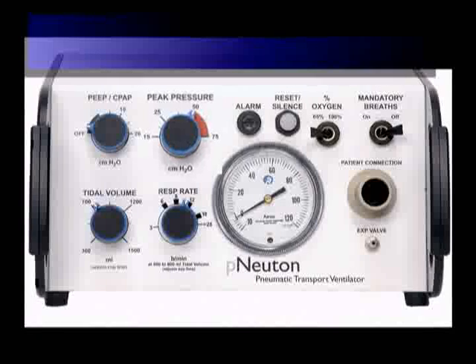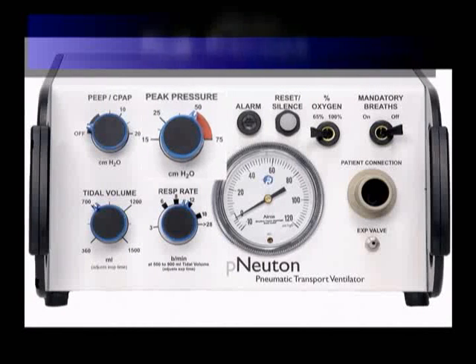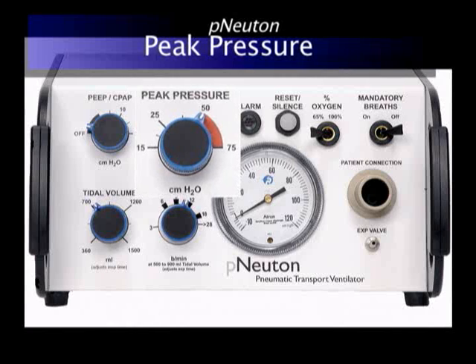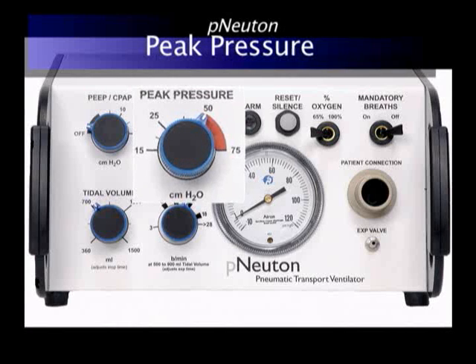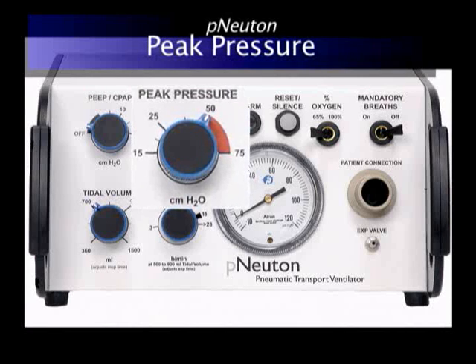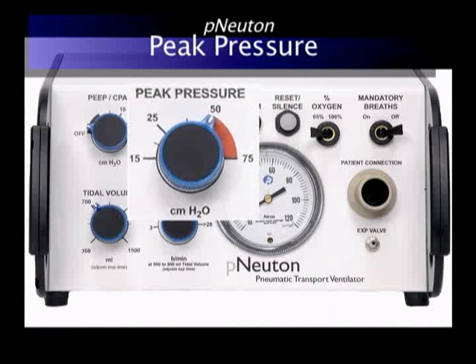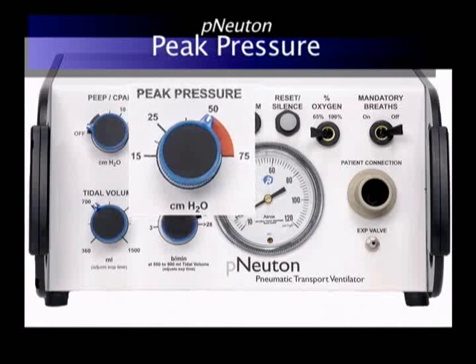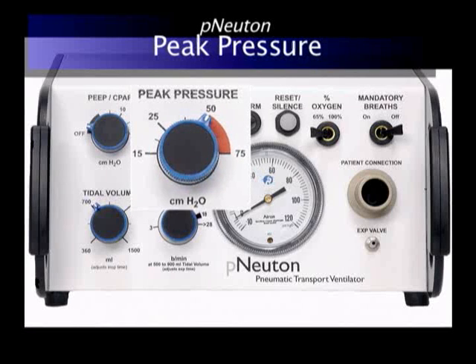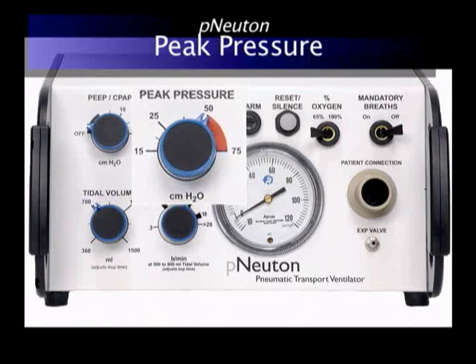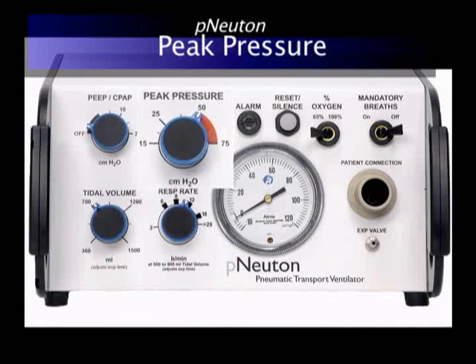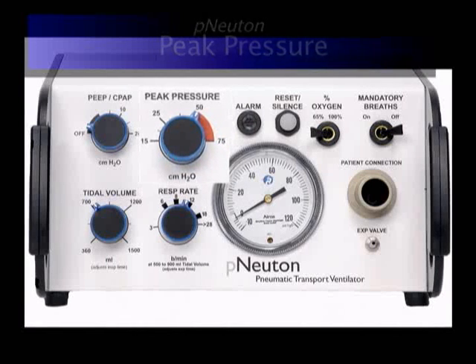This is the peak pressure control. Set above delivered patient pressure, this control limits peak airway pressure to a maximum of 75 centimeters water. Additionally, this control would be used to set delivered peak pressure for pressure-limited breathing mode.